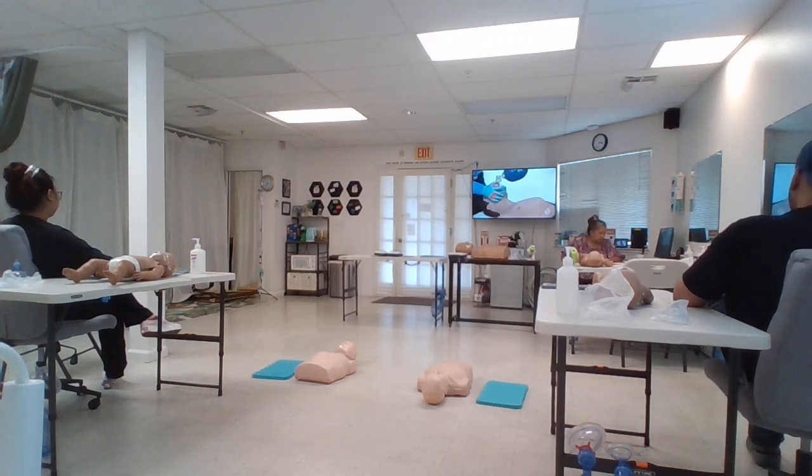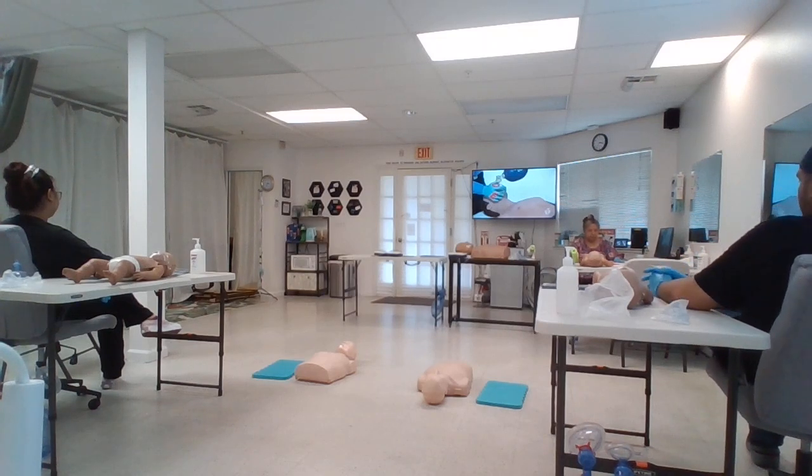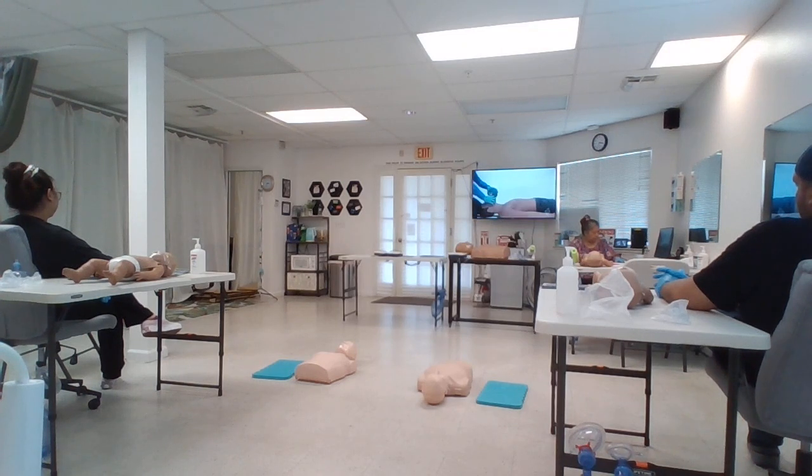The remaining three fingers of that same hand should form an E to reach past the edge of the mask along the bony rim of the jaw. To tilt the head back, lift the jaw toward the mask and open the airway. Make sure you squeeze the mask with your thumb and index finger while lifting the jaw to achieve an airtight seal between the mask and the face. And squeeze the bag with your other hand or push it against your leg or body.